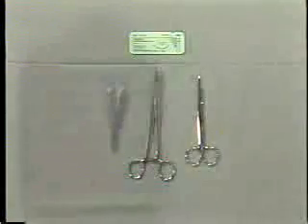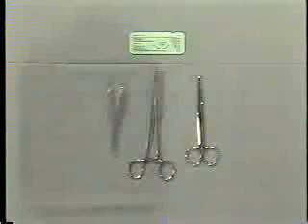Then the wound is irrigated, preferably with sterile saline, but clean drinking water will also do. The area immediately surrounding the wound may be painted with an antiseptic, but there is no need to put antiseptic, peroxide, alcohol, or any other agent directly into the wound. Don't try to substitute these agents for proper debridement and cleansing. After sterile draping, you are ready to suture the wound.